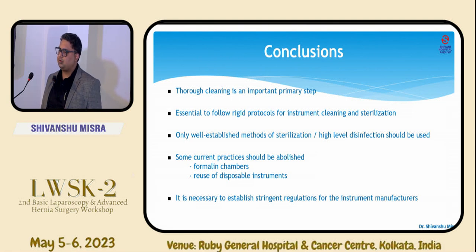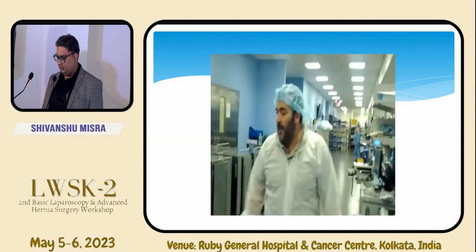If you're using Karl Storz, if you're using Olympus, whatever, there are specific guidelines from each instrument manufacturer. You have to follow those protocols specifically for the sterilization. So this is a small video.